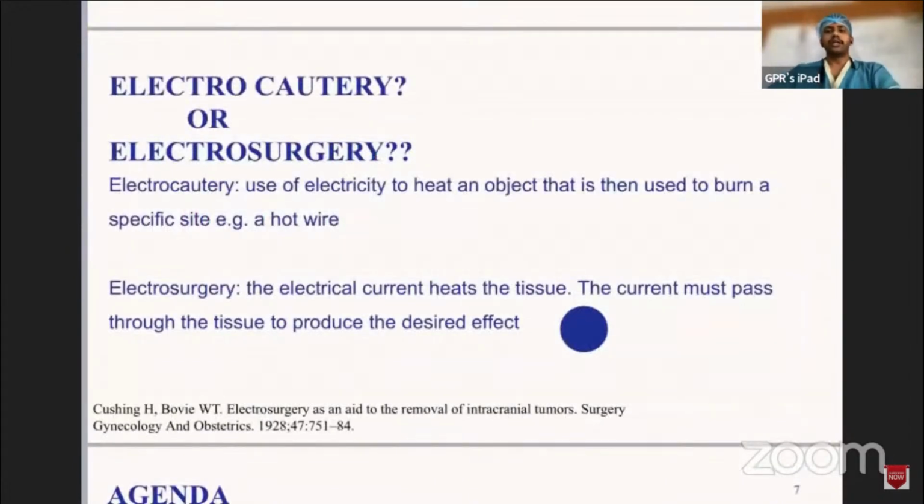So, coming to electrocautery or electrosurgery, the first or existing kind of electrocautery machine was prepared by a biophysicist by the name of William Bovie. He gave this concept of the electrosurgery unit or electrocautery unit, based on the principle of d'Arsonval, stating that when a high frequency radio frequency current is passing through the tissue, it fails to produce any amount of neurostimulation or muscular stimulation.